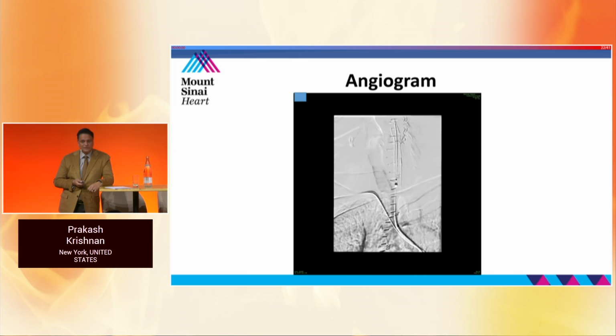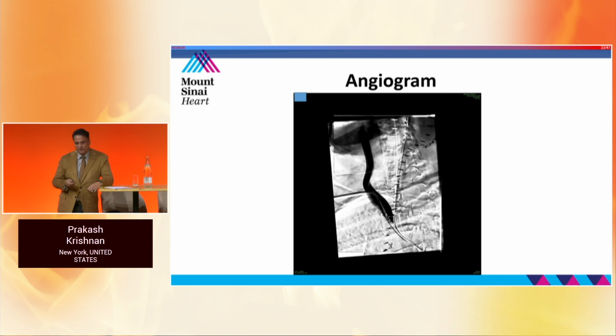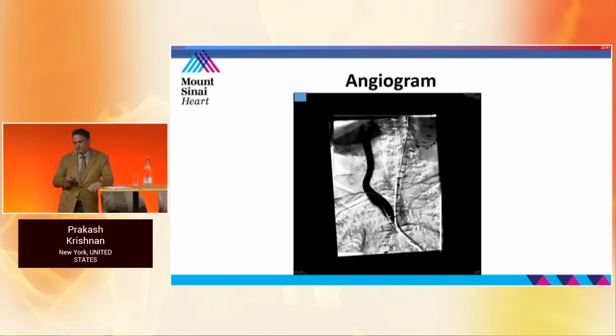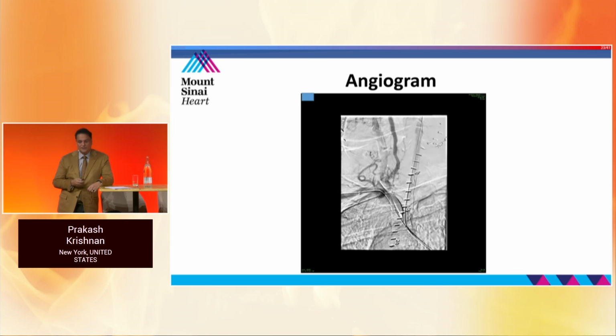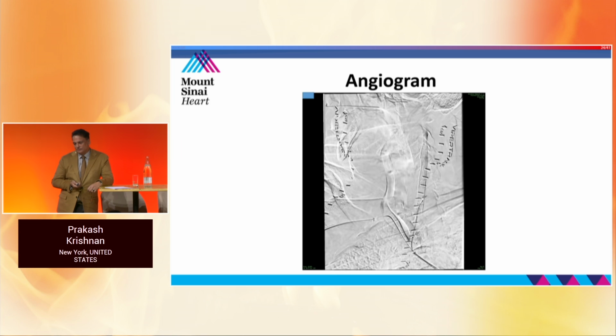We called our neurointerventional team, which was on site, and again, we do carotid stents early in the morning, so everybody's available. They all were there at that time, and we're giving their input on what to do. So we said, let's go ahead and fix this. We fixed the left common carotid. We established flow, and now we had to tackle the right common carotid. So at this stage, we went ahead, retrograde wired the right common carotid with great difficulty.